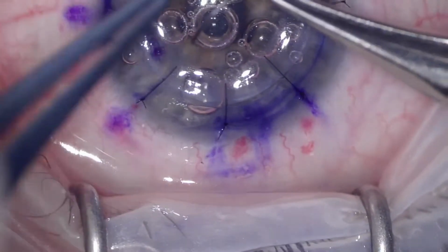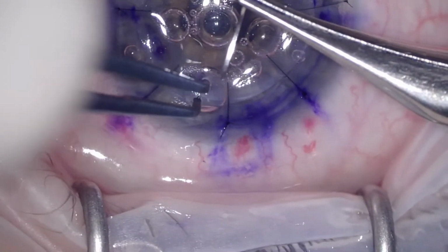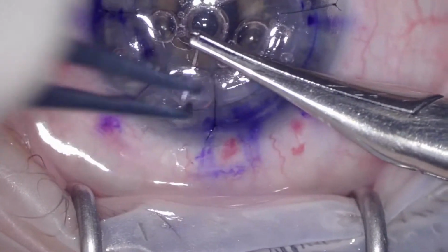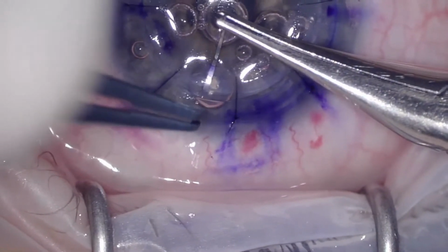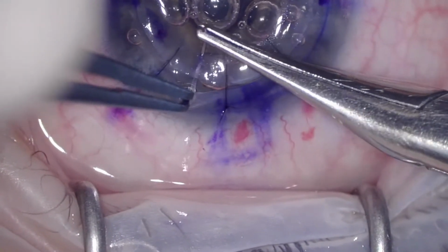Now you don't want to use any viscoelastic on the ocular surface while suturing the DALK. You don't want any viscoelastic to get trapped in the gap between the donor and the host. So I tend to ask my assistant to just keep the donor graft as moist as possible.